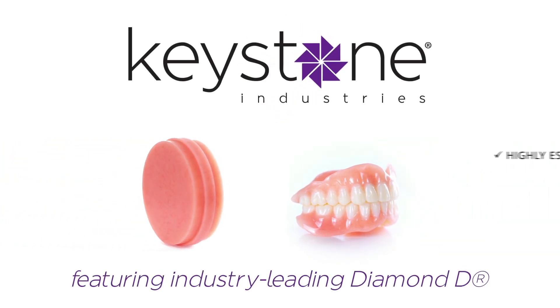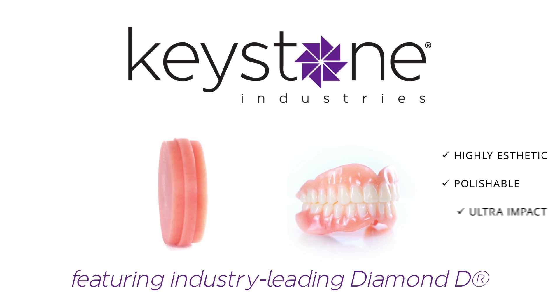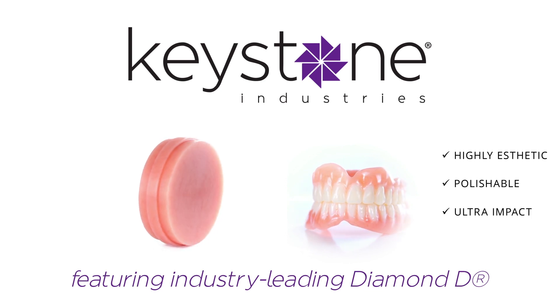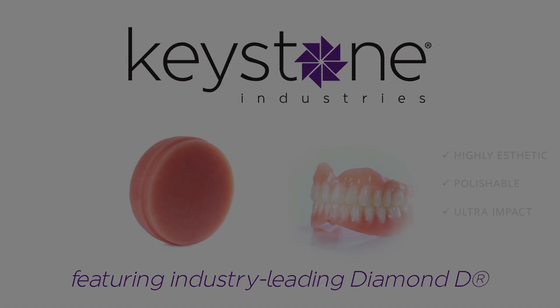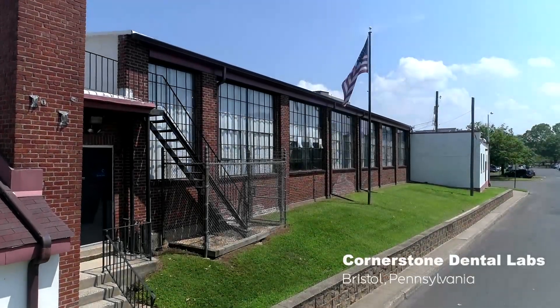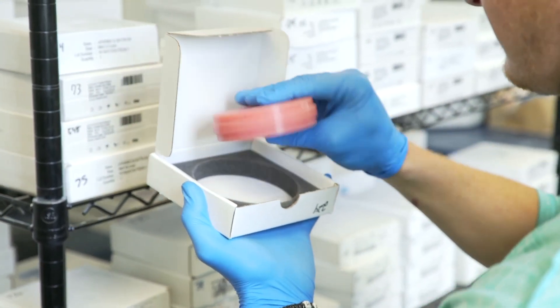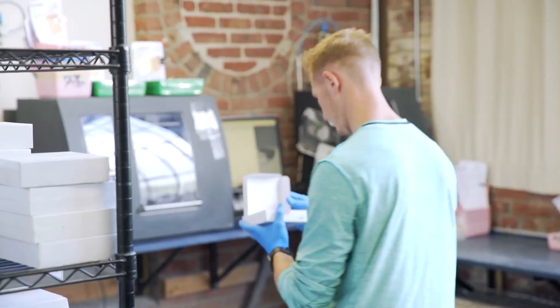Utilizing Keystone Industries Diamond D, our Key Mill denture base disc is the new standard for creating comfortable, natural, and easy to produce dentures. Each Key Mill denture base disc comes ready to mill. This process saves time and keeps you efficient with no need for molds or mixing acrylics.